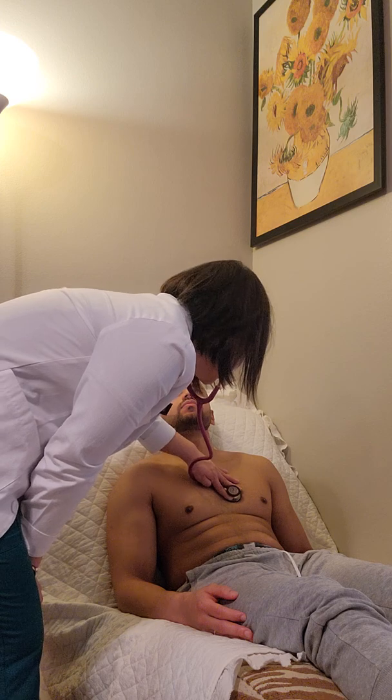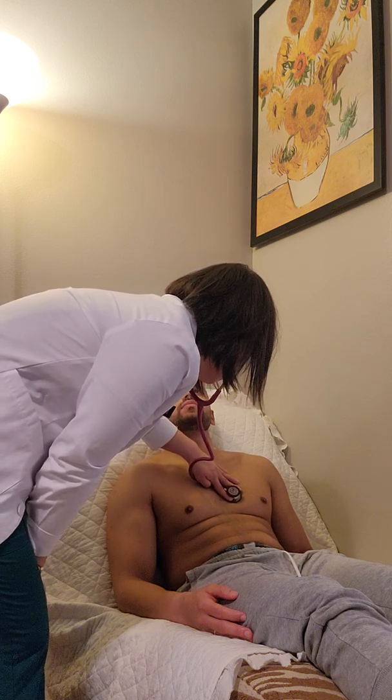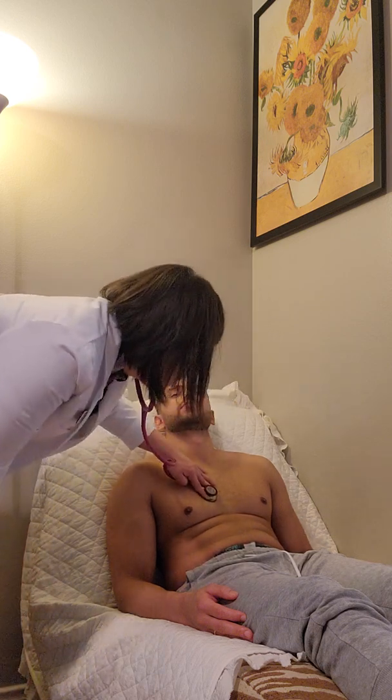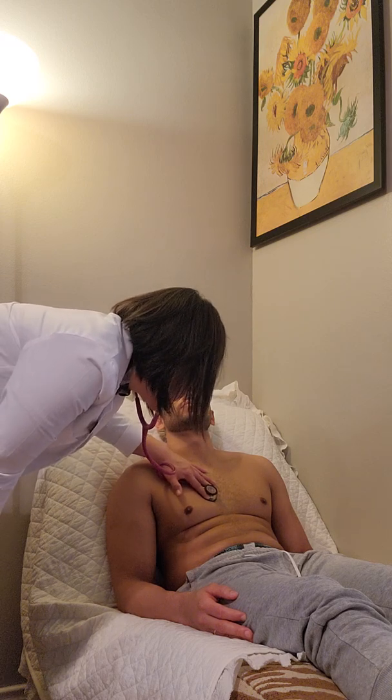And S1 and S2 are appreciated. I do not hear any S3 or S4. I'm going to move across to the other sternal border, 2nd intercostal, left sternal border.